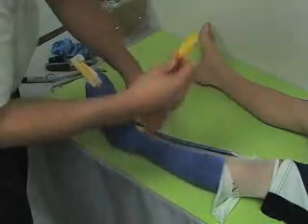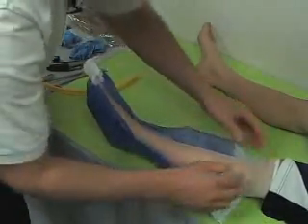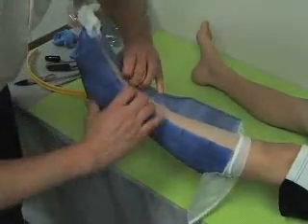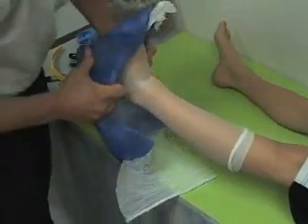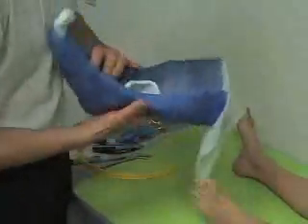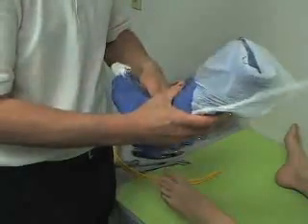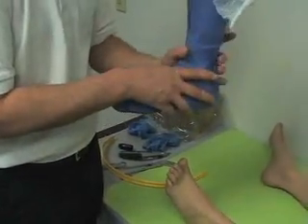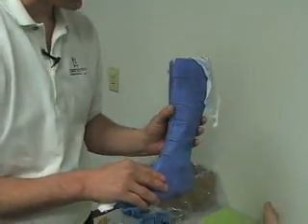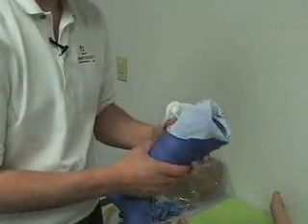We are now ready to remove the cast. Take any wrinkles out of the cast and seam it back up. It is important that when you have the cast off, you either tape it or seal it before you ship it off so it does not deform. A wet cast thrown in a box will flatten out and we lose the shape of the cast.